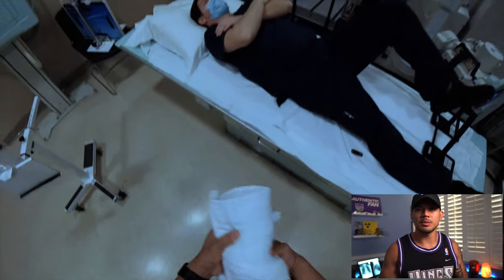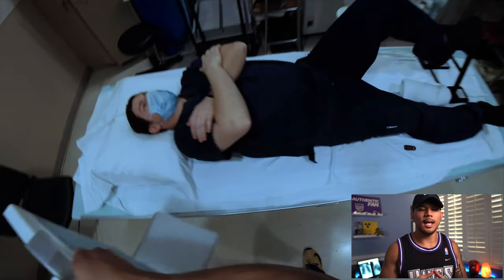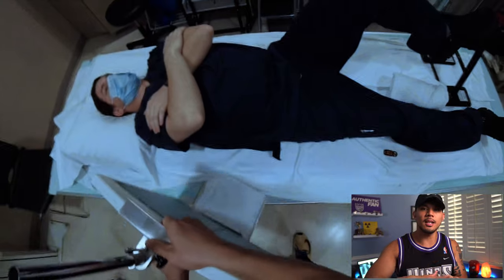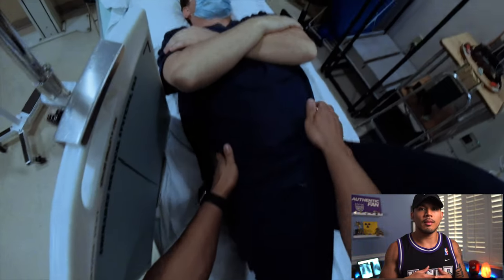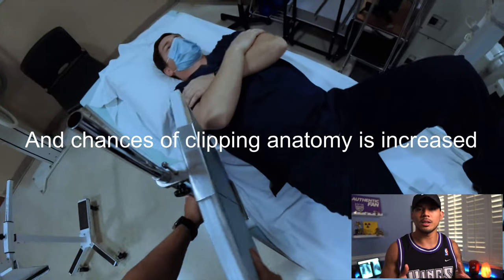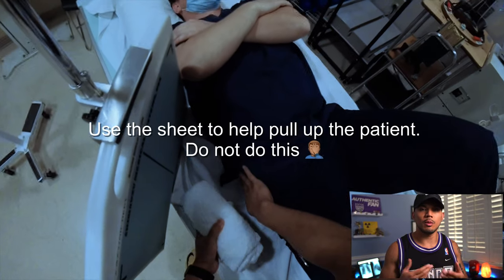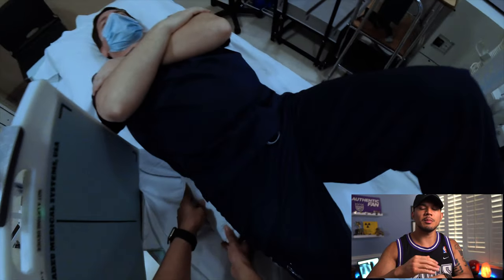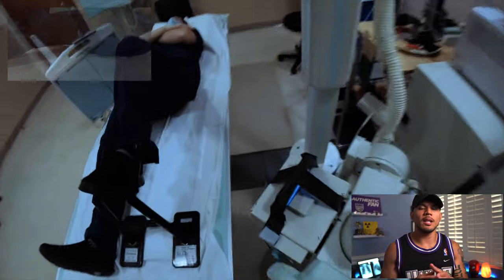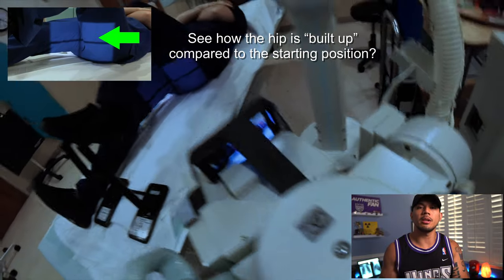So this isn't the best example because my patient is actually on a table and not in a bed. But if you can imagine, if your patient is a post-op or they're on a gurney and you have those plush beds and they're sunken in, and you take the image without building the hip up, you're gonna run into a lot of artifact. The springs from the bed, the cushion from the bed. So with that, that's when you find some linen and then you roll that up. And I didn't do the best demonstration here, but you wanna tug on the sheets and stuff it under that hip so it builds that up, it rises that hip up. That way the hip is more in the center of the IR and you won't be clipping the posterior portion of the hip.